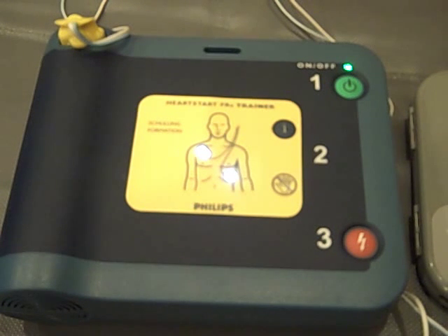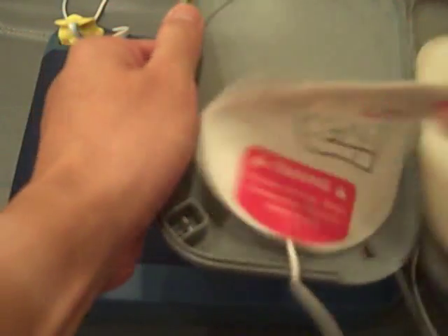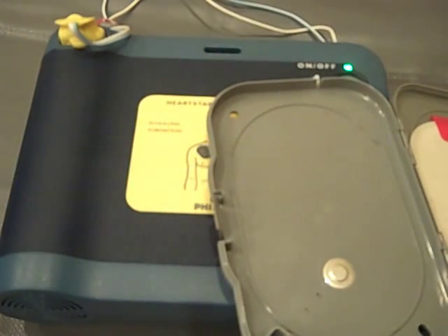Remove clothes from patient's chest. Peel white pads from gray plastic case. Attach pads to bare skin exactly as shown.